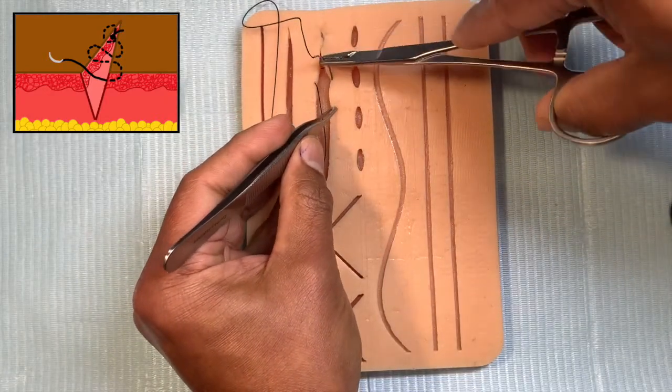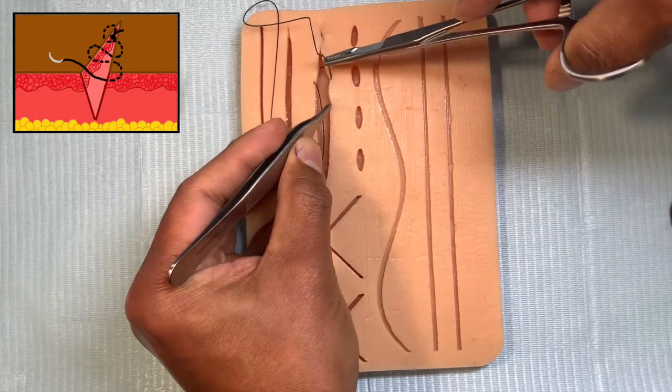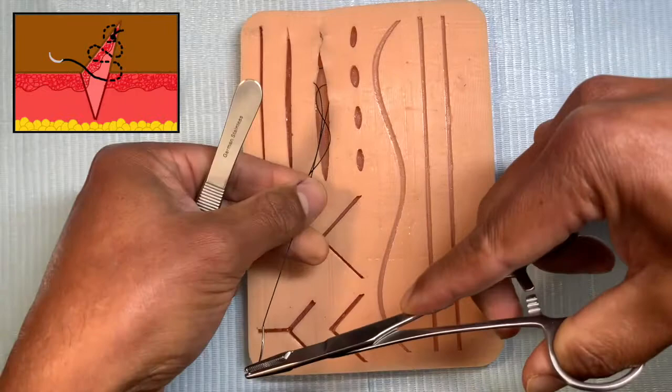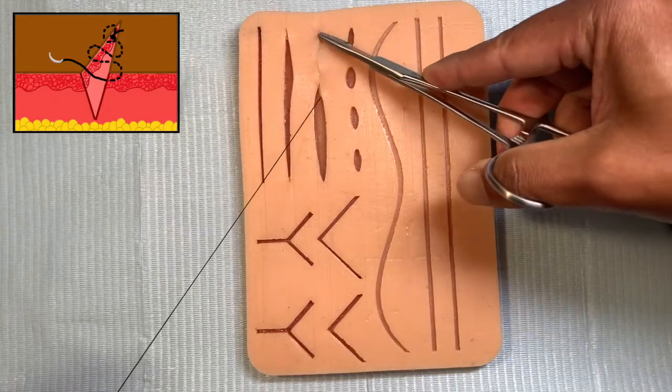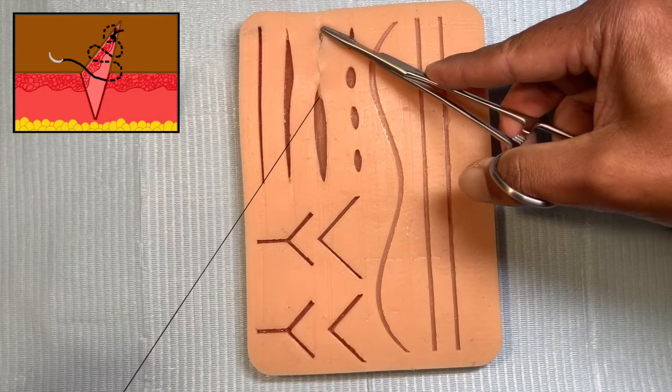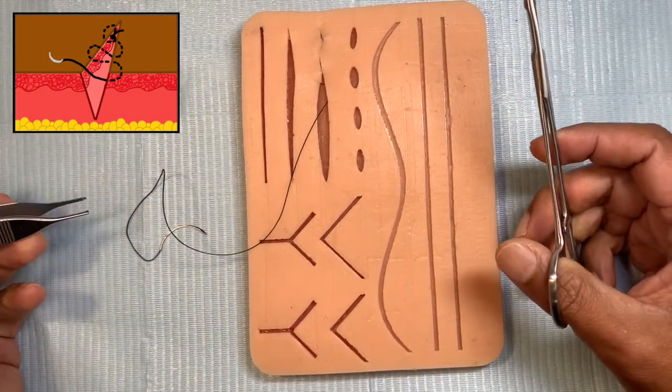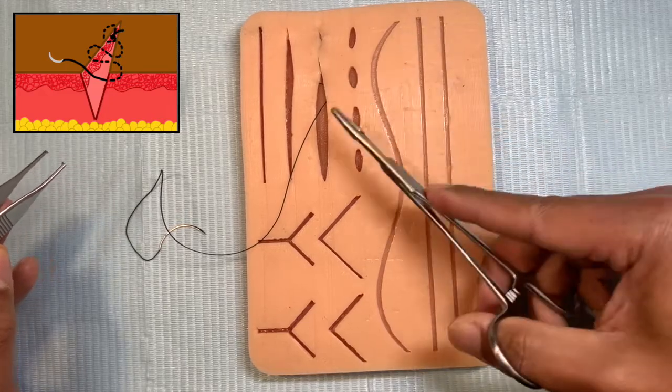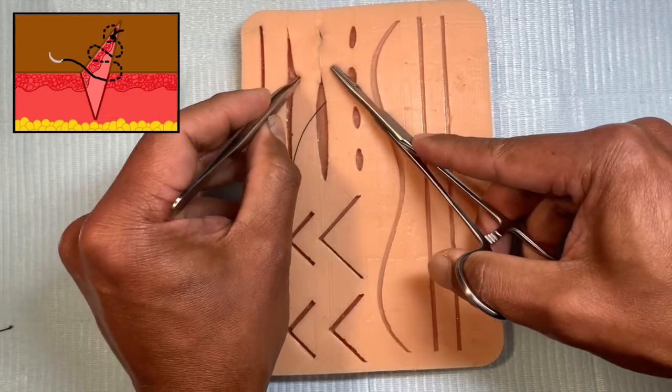We'll show one more bite. When you see the exit point from that side, go the opposite side just slightly behind because this helps to bring everything together. That's an important technical point. You've got the intracuticular closure, the start and the suture. The key is to take the papillary dermis, and remember that the bite from the opposite side should be slightly behind the bite from the other end so it has this drawing together effect.